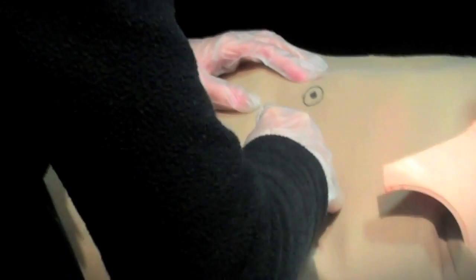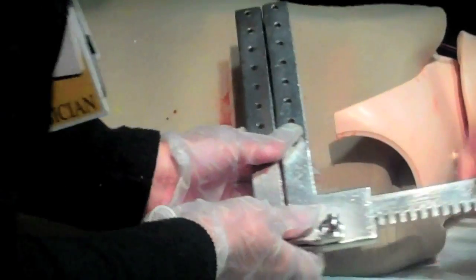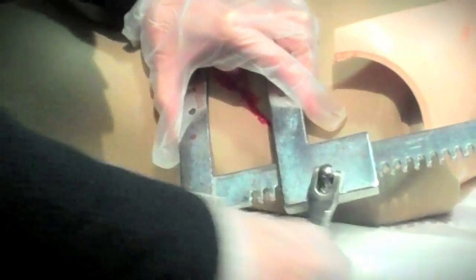We had a request from a faculty member to build a thoracotomy trainer for the emergency medicine residents at Washington Hospital Center. It's something they don't get to do very often, but it may be valuable to someone in the future in their practice when they go out into the world.